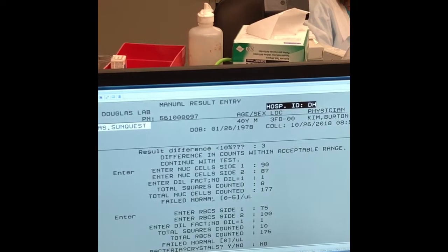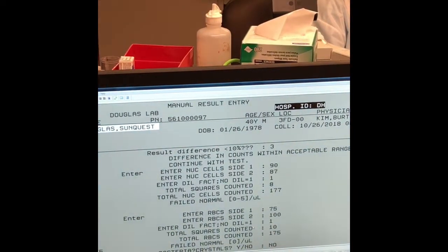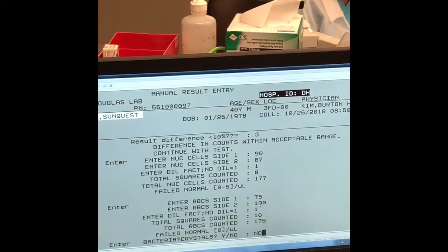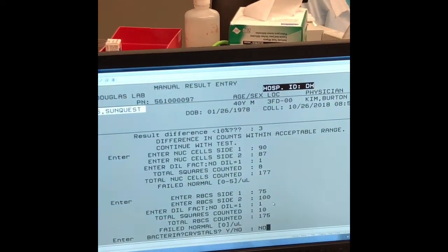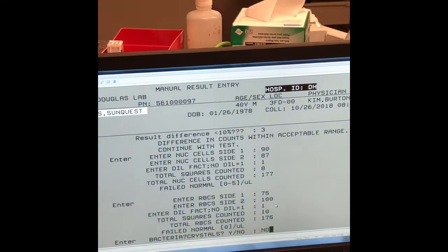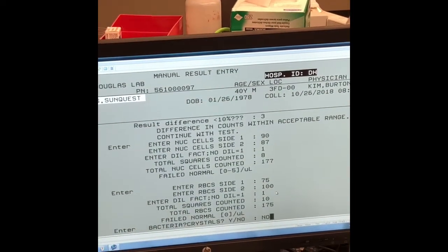They're saying it's still continuing and you're trying to figure out why. Sorry, it's saying it's acceptable. Okay. I tried to test it with the RBCs and we ended up learning now that the project requires only the white cell count. Oh, okay. The CAP inspection checklist. Okay, right.